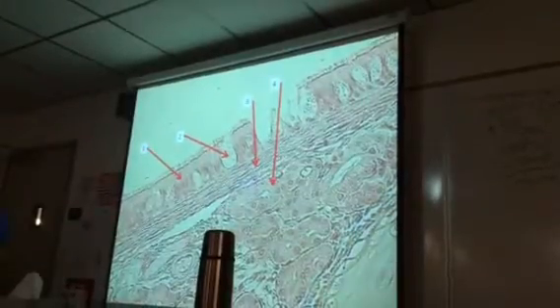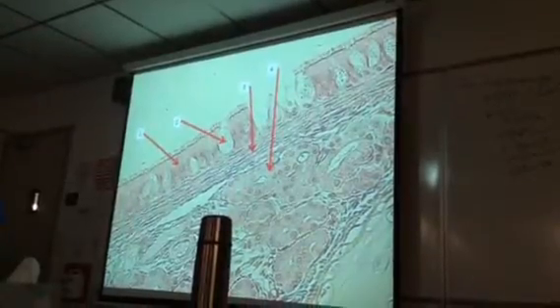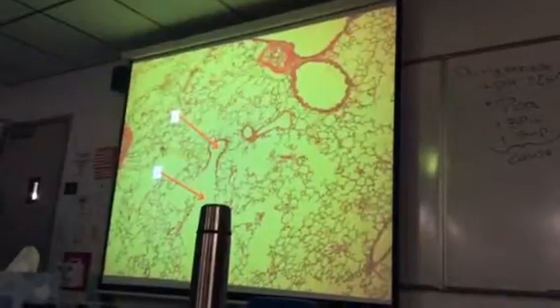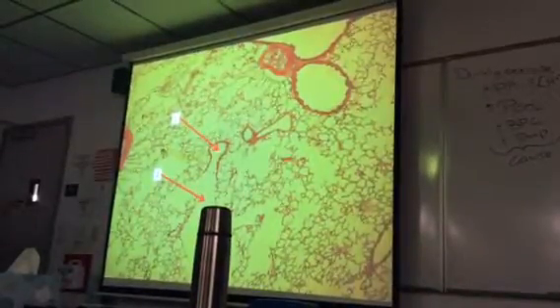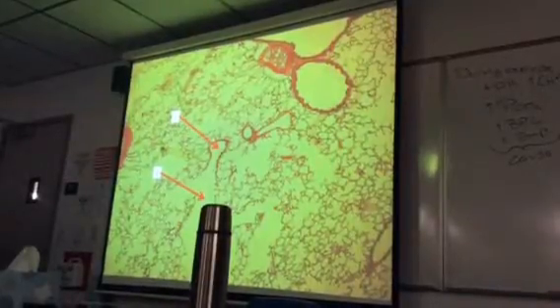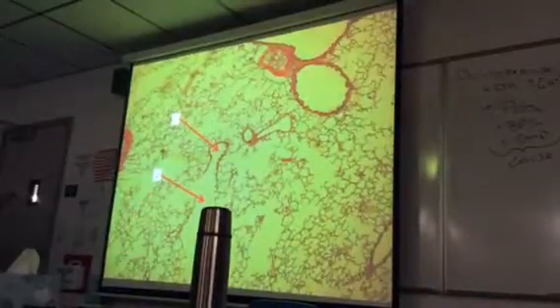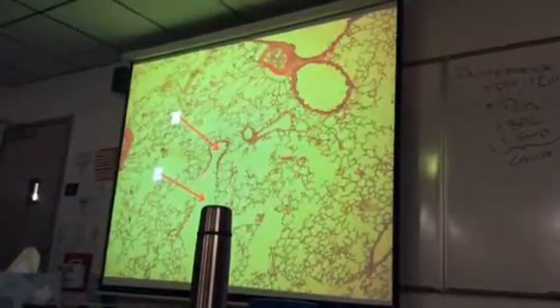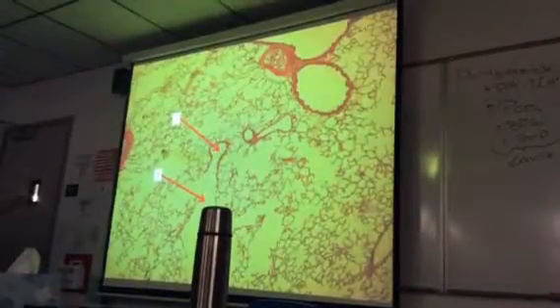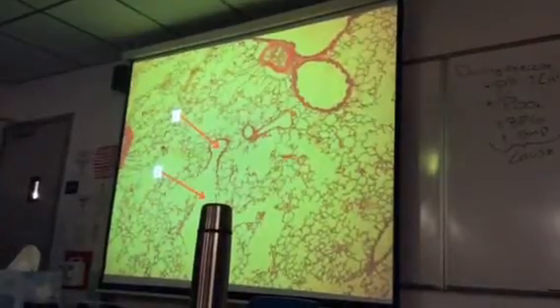Now 4 is in the submucosa, but I'm specifically pointing to the structure. It's a seromucous gland. Getting into the respiratory zone, 1 is pointing to the lumen of a bronchiole. 2 is the hallway, the alveolar duct. Okay, I could have pointed to inside there, or inside there. Those are also bronchioles. That looks like a blood vessel right there, though, because I see all the smooth muscle there. But I'm just pointing to these 2 things. So for this slide, that's all you have to worry about.